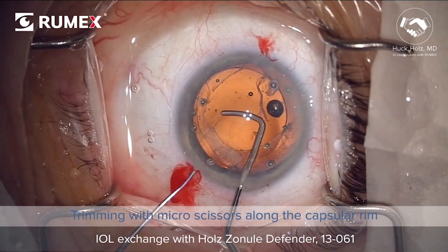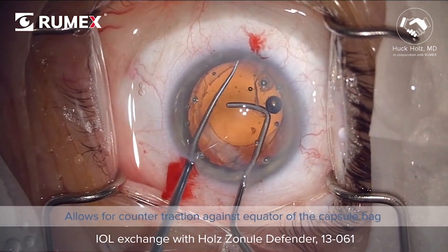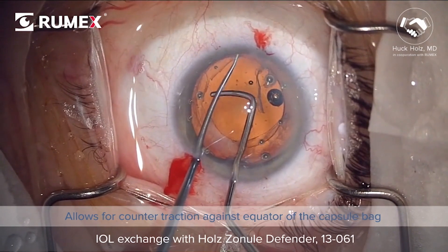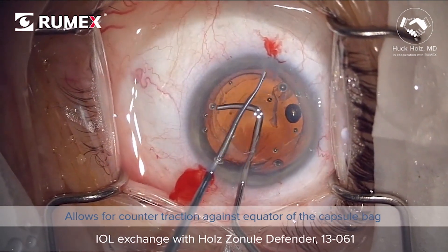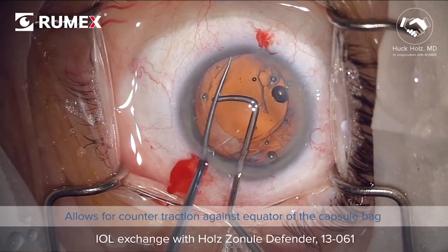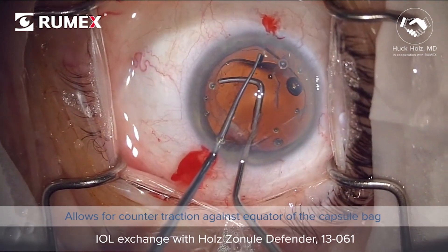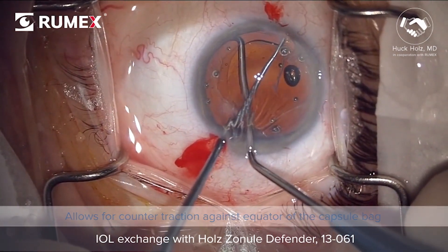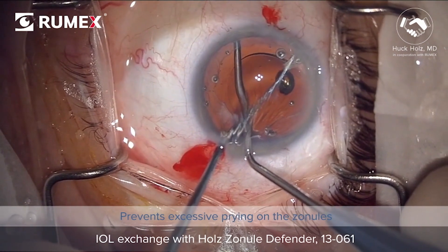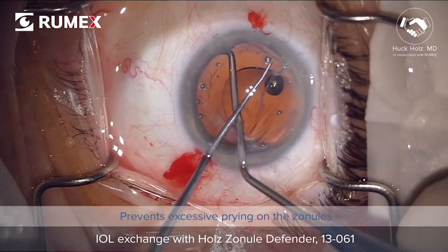The Zonule Defender device, which is rounded and polished and curved to approximate the capsule bag equator, is inserted to allow for counter traction against the equator of the capsule bag. As the haptic is pried free, the counter traction device prevents excessive prying on the zonules and thus disinsertion of the zonules.